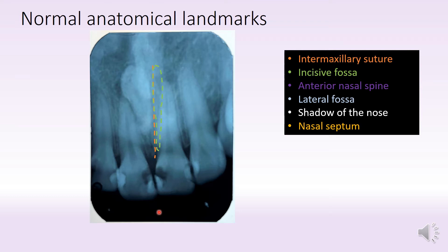Then we have the anterior nasal spine, which is the most radio-opaque structure seen there — dense, way up somewhere near the area of the nose. And you have the lateral fossa; you can in fact see the lateral fossa on both sides. It's a depression where there's a lesser amount of bone density, and that's why it appears as a lateral fossa.